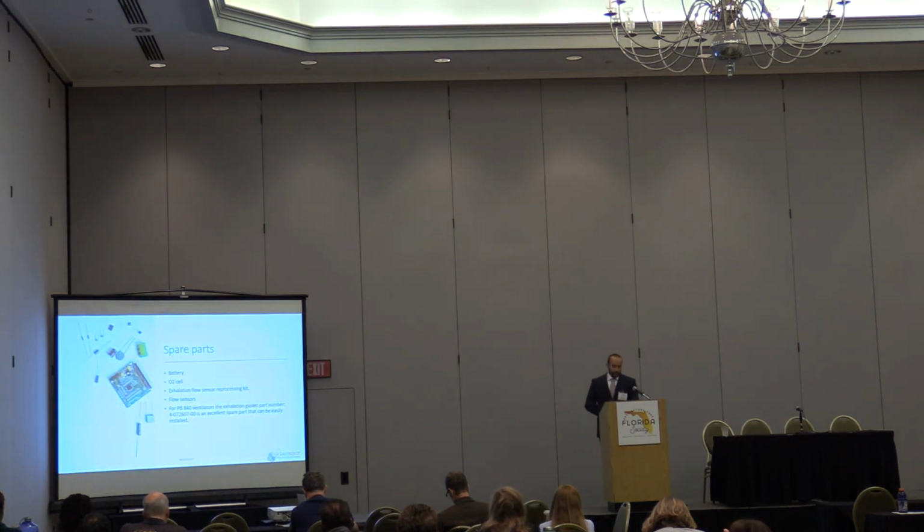Okay, some spare parts to keep on hand if possible, to encourage your biomed department. Keep some batteries, oxygen sensors, exhalation flow sensors, or inspiratory flow sensors. Just a few. Reprocessing kits if you're using this 980.